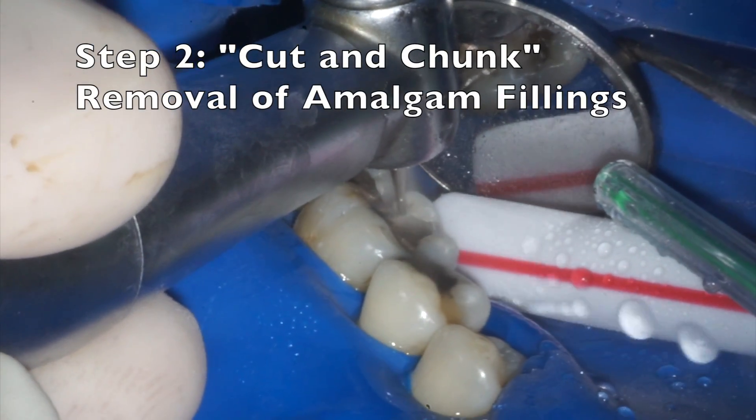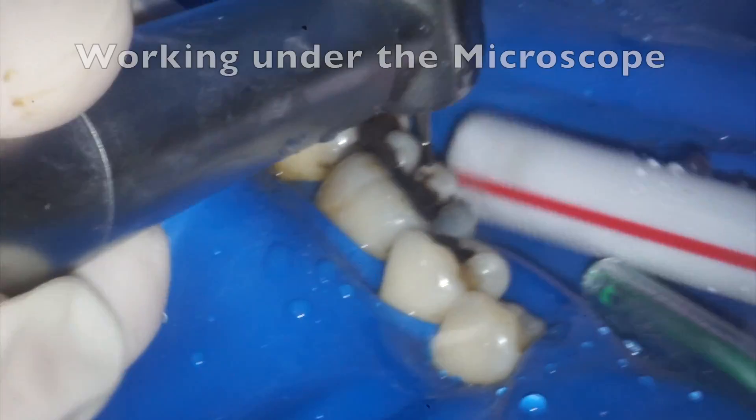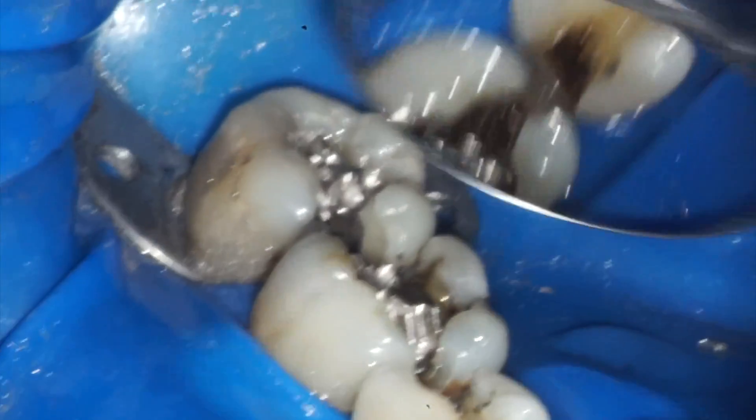Now we're ready to remove the mercury amalgam fillings. We use the cut and chunk method, which minimizes the amount of mercury vapor that is released. We are working under the microscope here, which allows us to make very small and precise cuts around the fillings to remove them.